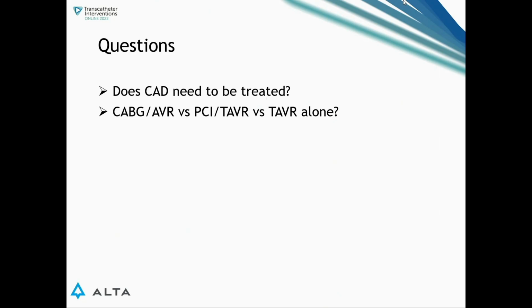The second is whether the coronary anatomy is a risk factor, particularly whether the safety of rapid pacing during transfemoral TAVR would be compromised with the burden of coronary disease. And the third is how the selection of the particular valve impacts our ability to reaccess or intervene on the coronaries at a later date. So maybe I'll stop there and turn it over to Sushil and the group.